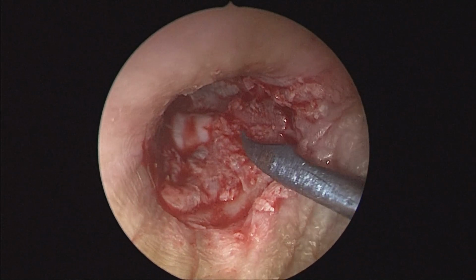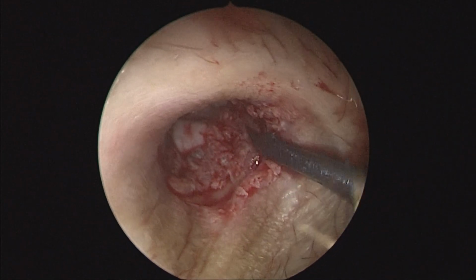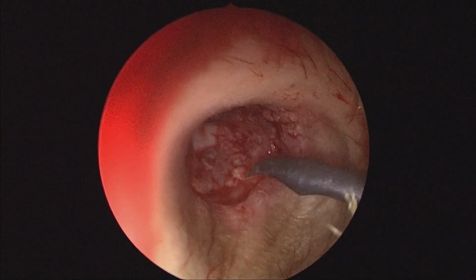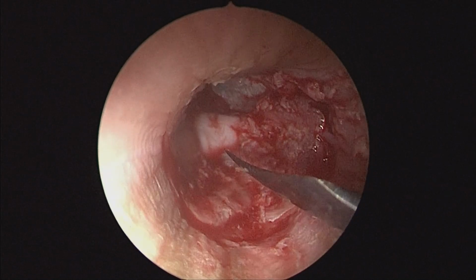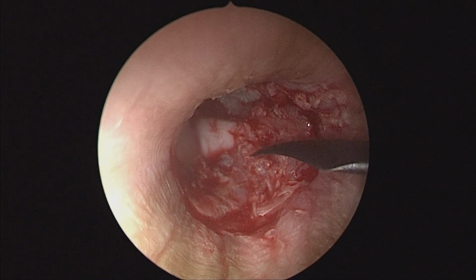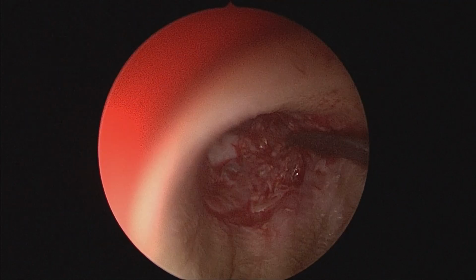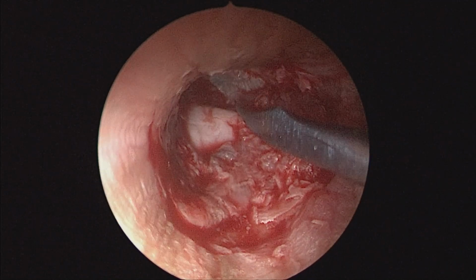We check once again for the integrity of the flap and the graft, that they are well opposed, in contact with each other nicely, snugly, and not moving and loose from anywhere. And any amount of loose epithelium can be placed over the bone, where the bone is bare. And as you see, the whole assembly appears to be quite snug.